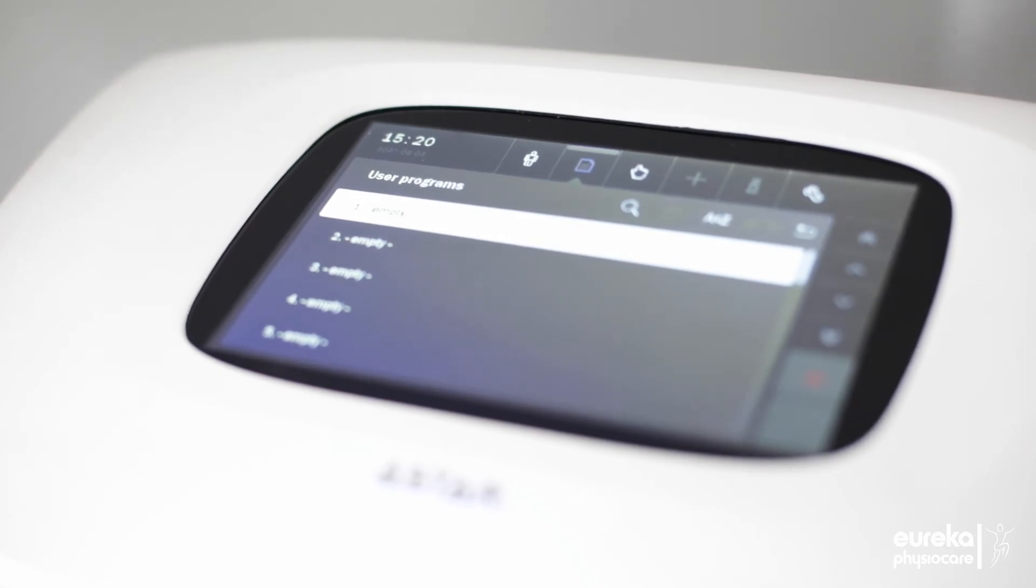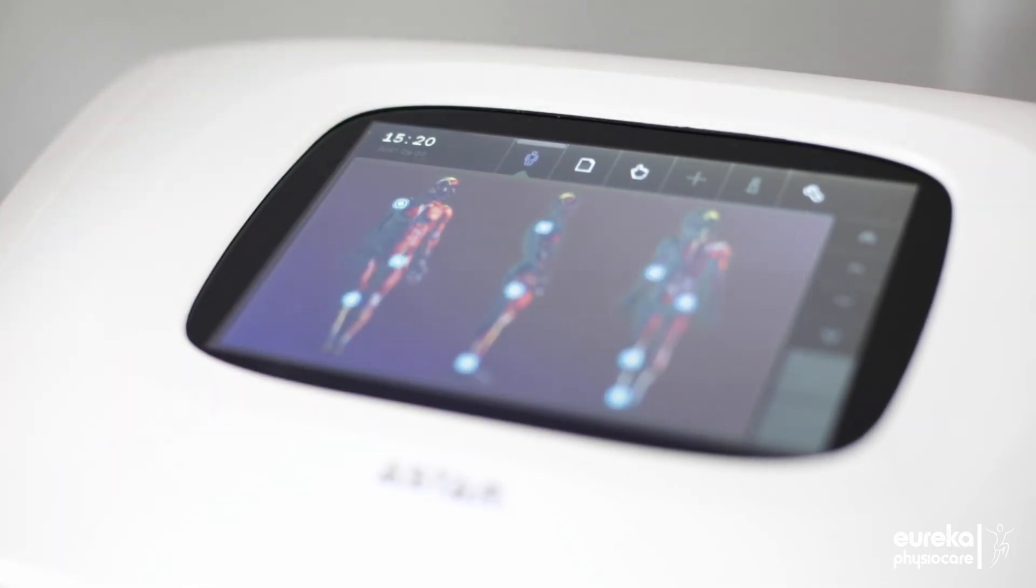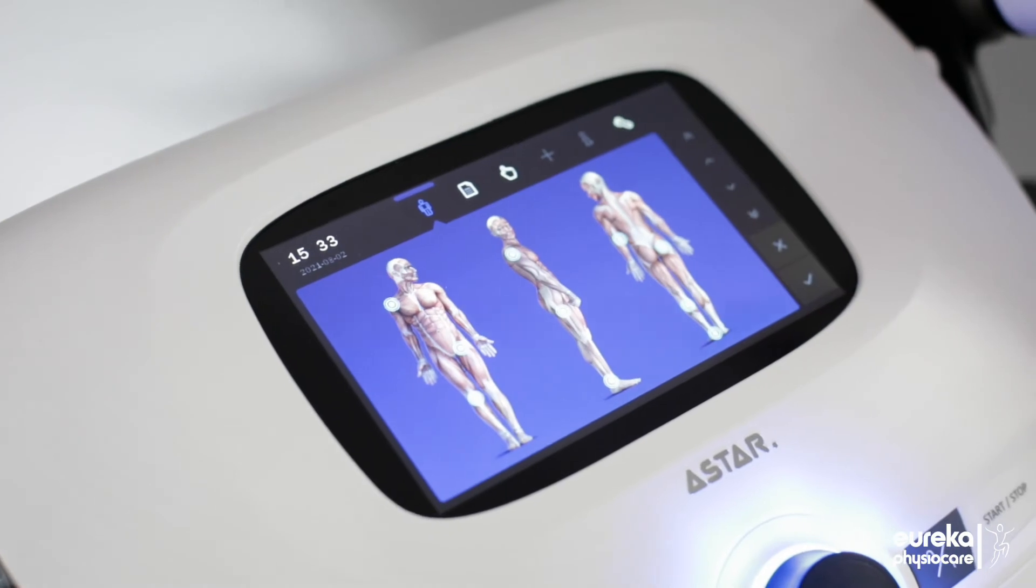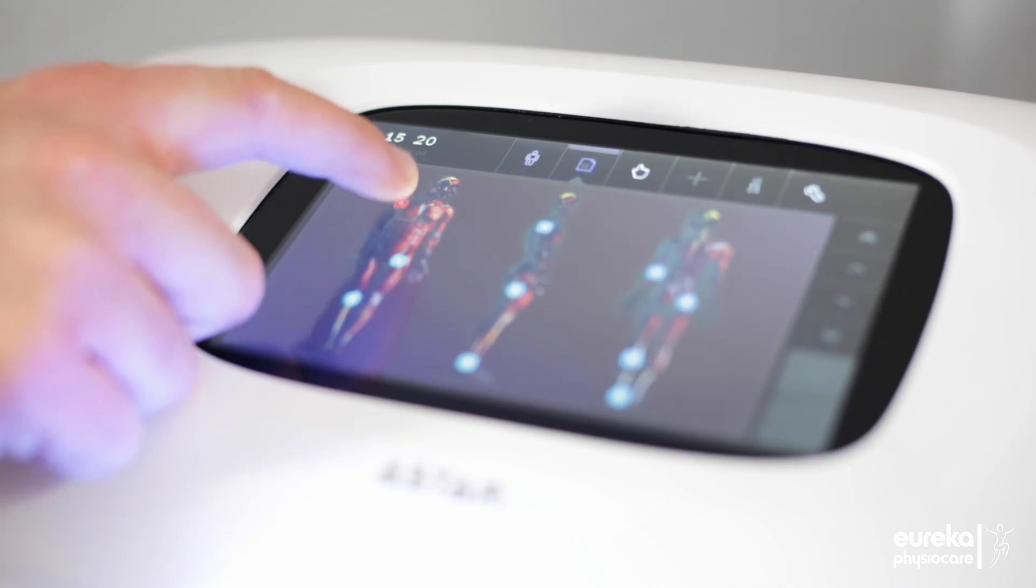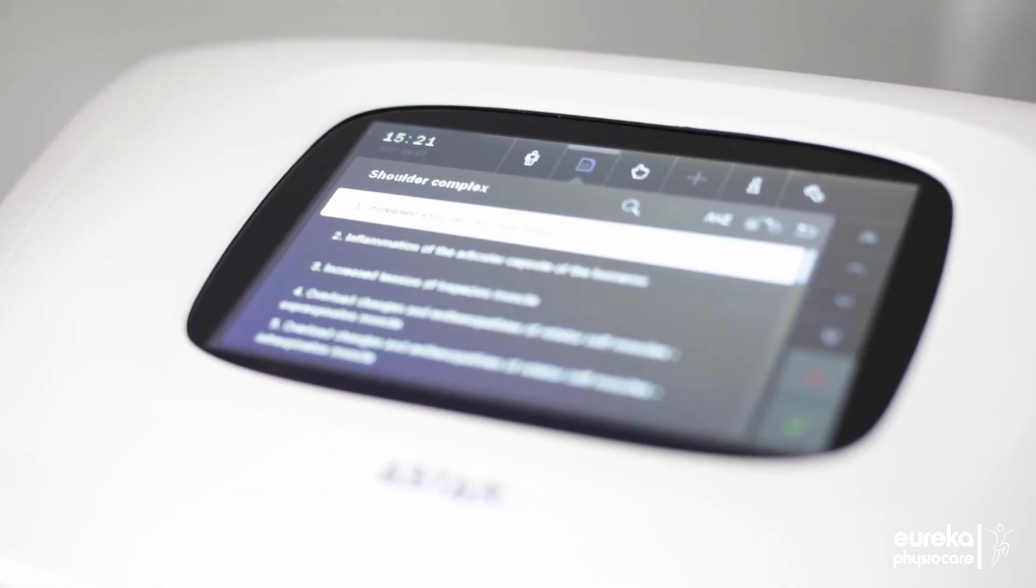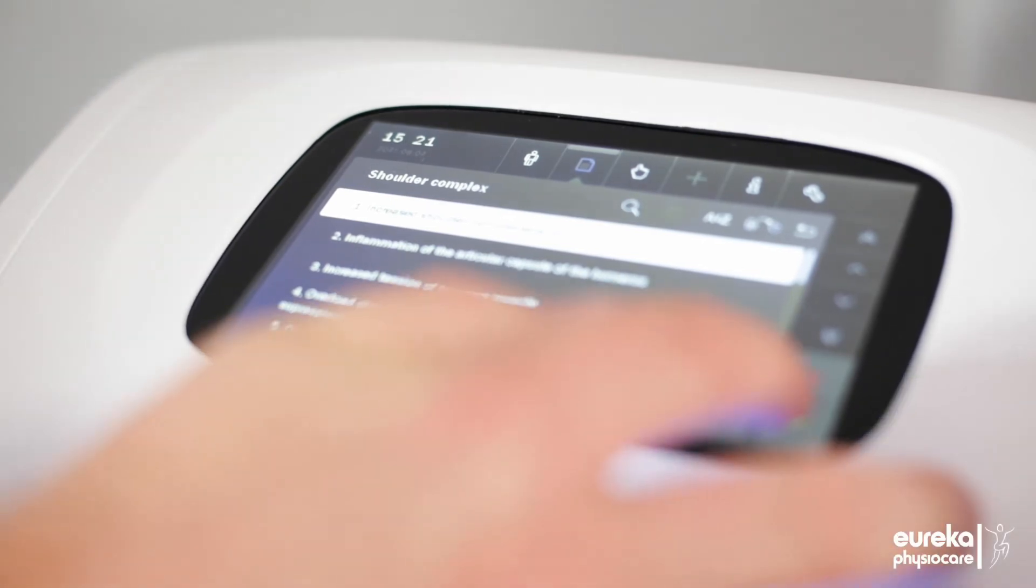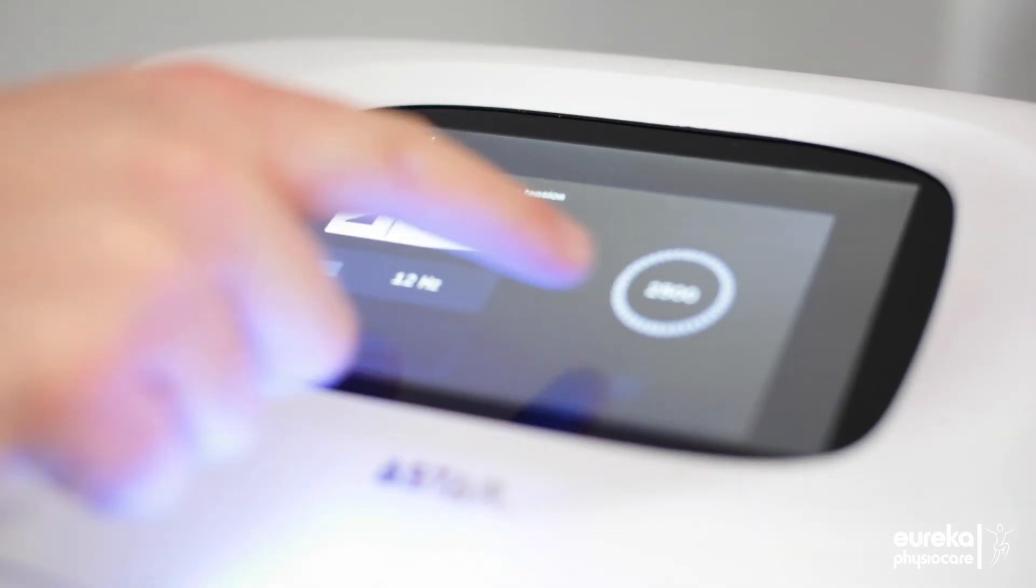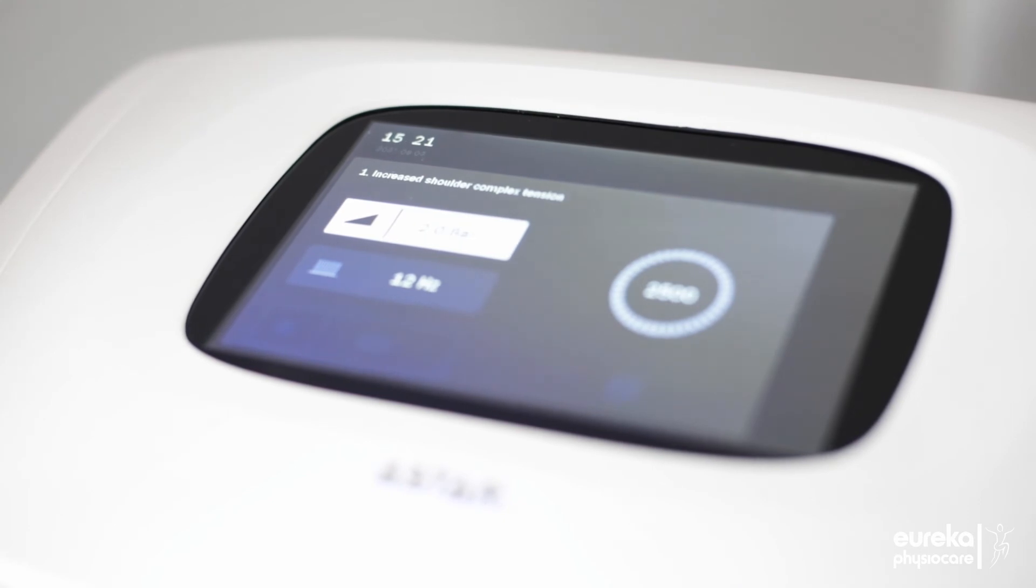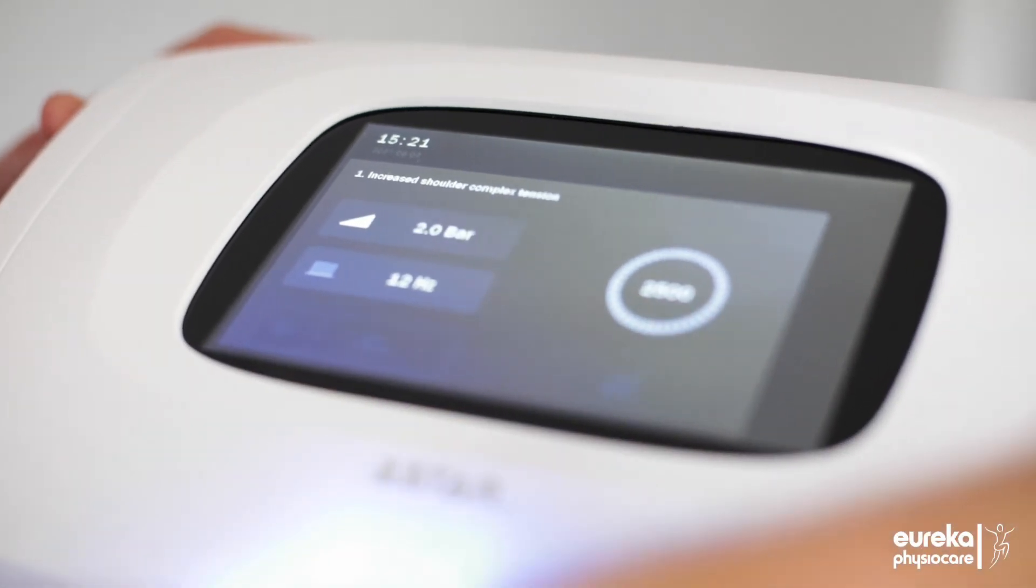The preset user programs can also be accessed by the anatomical mode which allows you to select the area of the body that you might be treating, and this will bring up a list of the preset programs for that body area. You can then, as with the other preset programs, load that information and it pre-populates the bar pressure, the hertz, and the number of shocks ready for you to start.